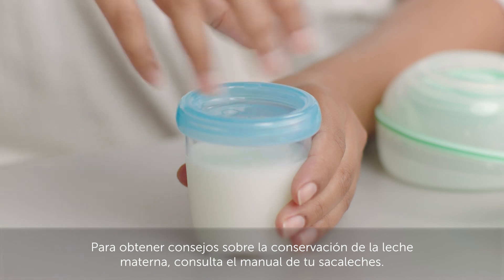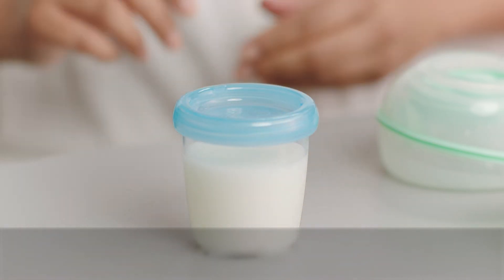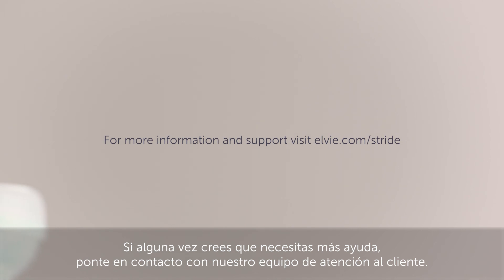For advice on breast milk storage, please refer to your pump's manual. If you ever feel you need some more help, please contact our customer care team.